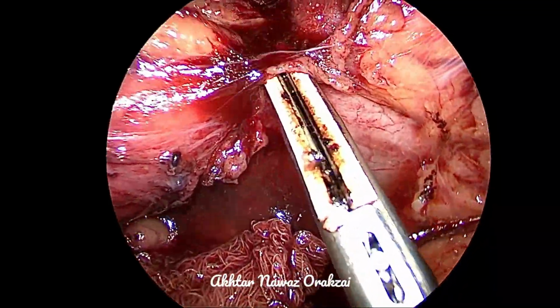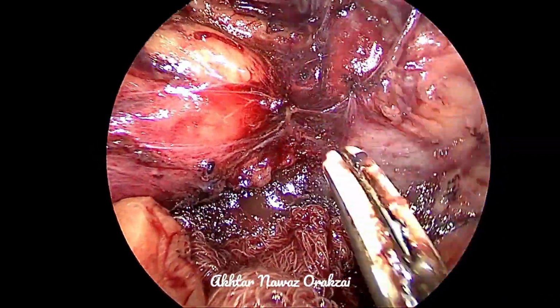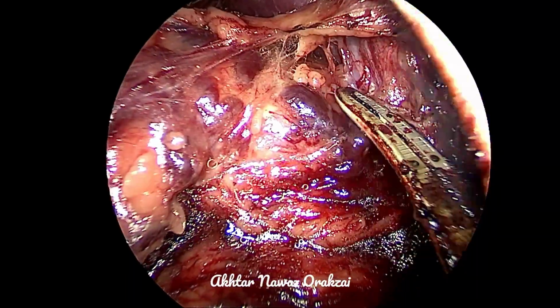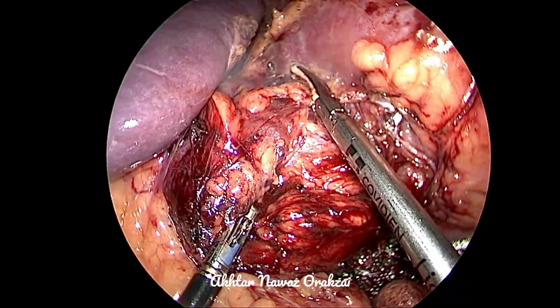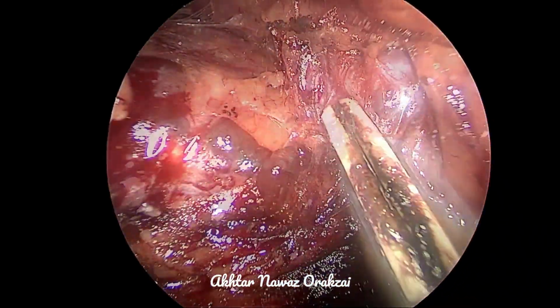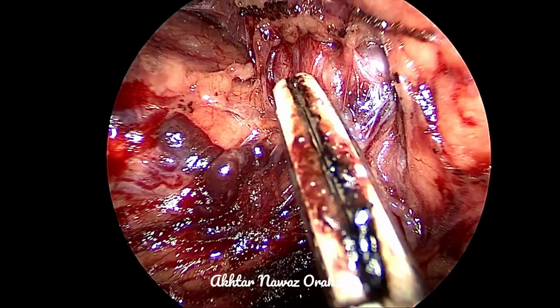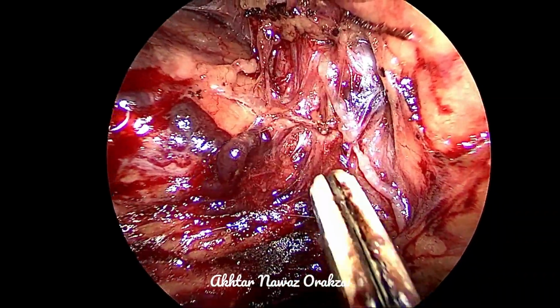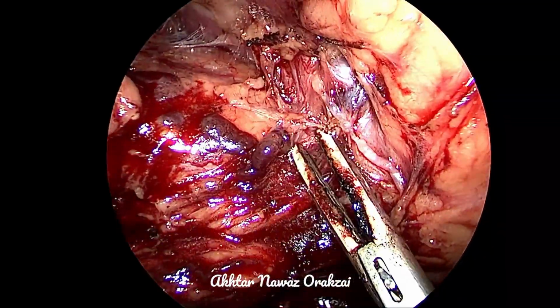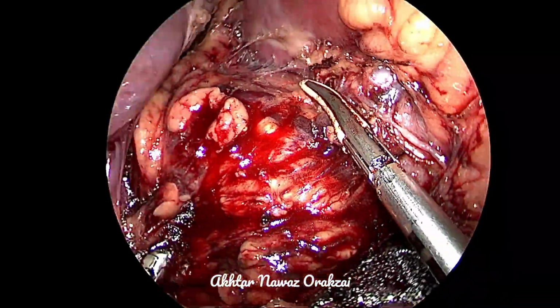So the dissection on the medial aspect of the adrenal gland towards the kidney, here you can see that there's a branch to the upper pole of the kidney, and this upper polar branch will give an artery. Here you can see the pulsations very clearly. So here the dissection has to be done extremely carefully, not to use diathermy excessively, because the artery can go into spasm and the wall of the artery can be injured.